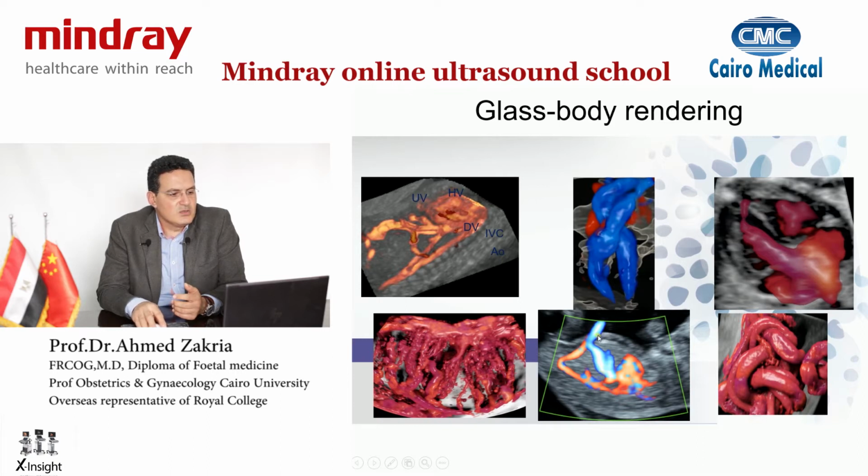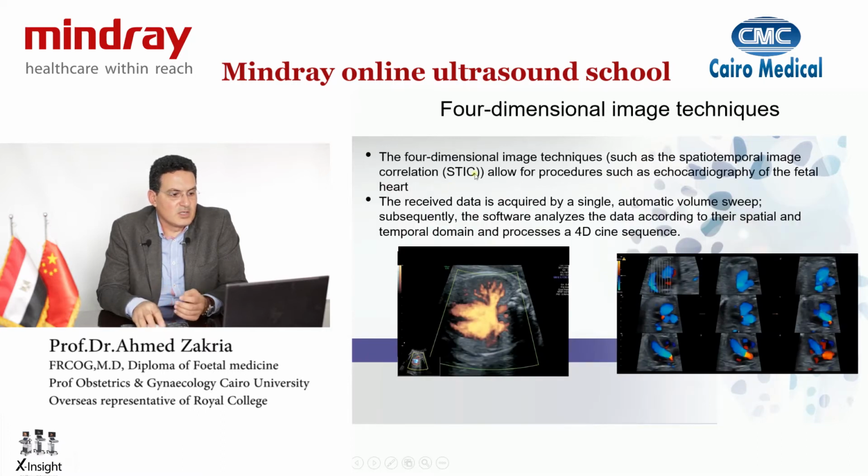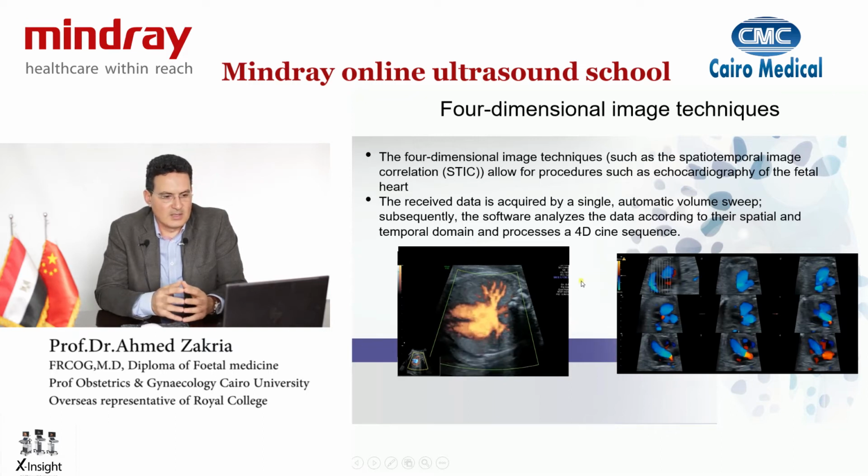Again, you can use that volume imaging to obtain a thicker slice, and not just take a single slice of what the standard 2D probe can do. So you can take a thicker slice, apply the color Doppler to it, and obtain a volume of moving structures. For instance, the heart, sometimes thicker slices are more appreciated, for instance, to check for septal defects.